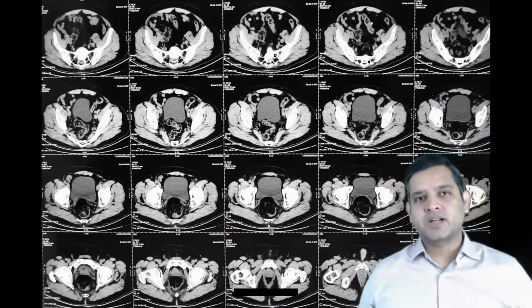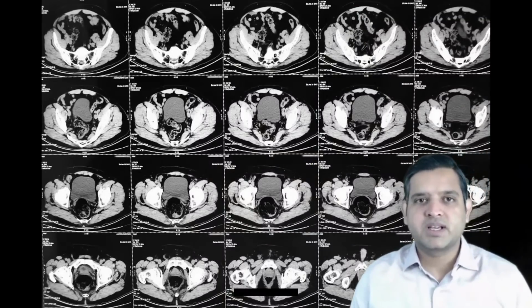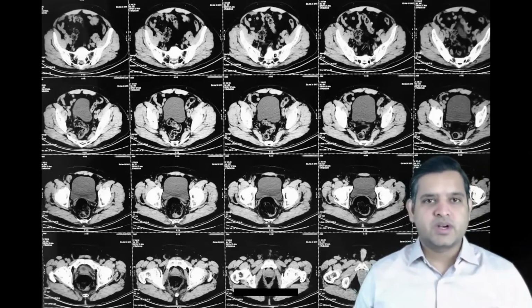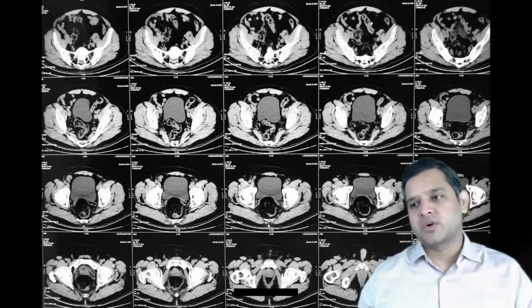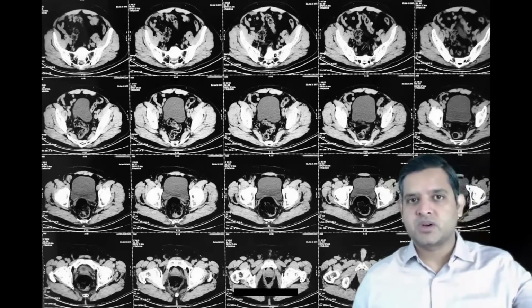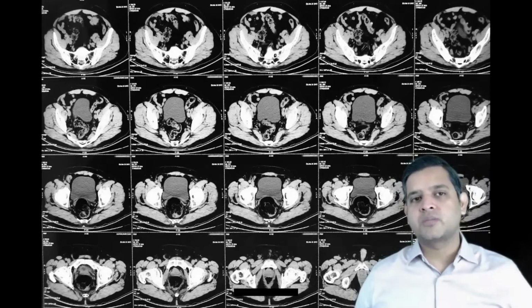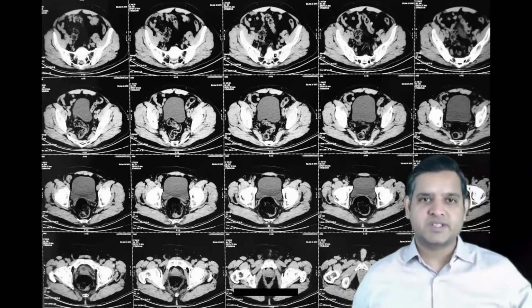So this is the first pattern of question that you can get in the exam. The examiner can give you this kind of image and simply ask you to name the investigation. What is the name of the investigation? You can put it into WhatsApp or Telegram or the comment section of the app, what do you think this particular image is. This is a common question when the examiner gives you an image and the only question they ask is name the investigation.